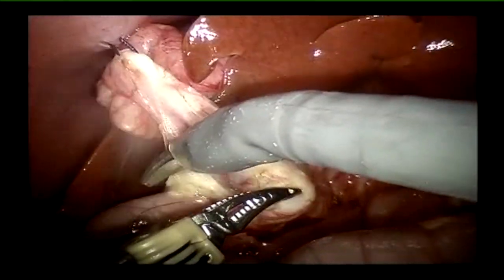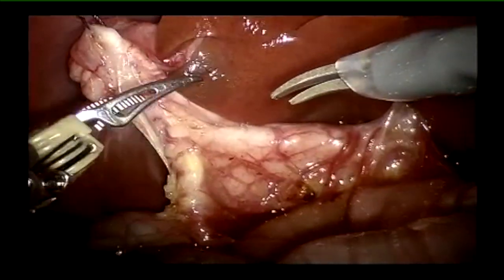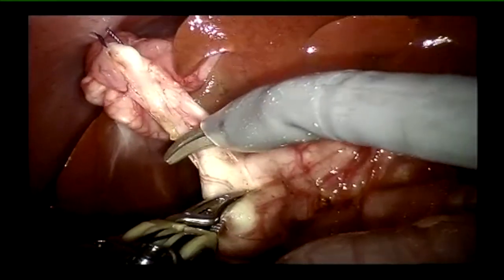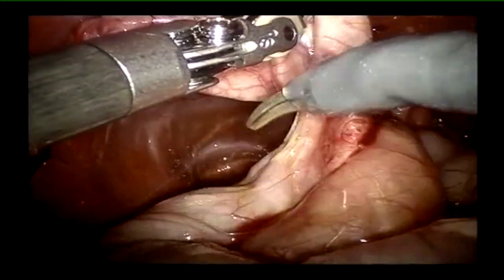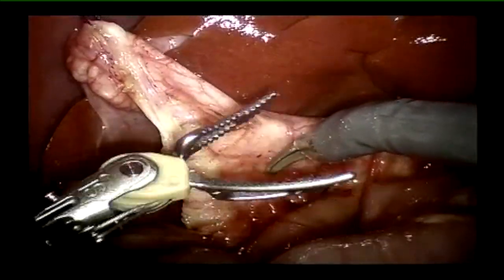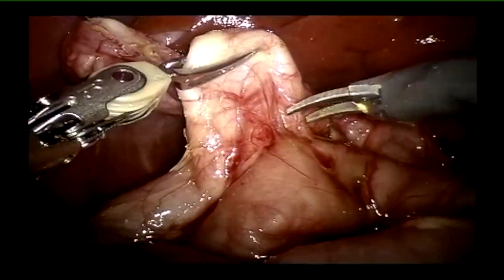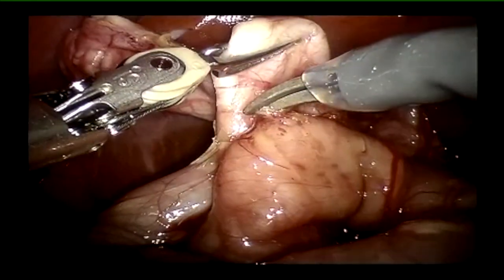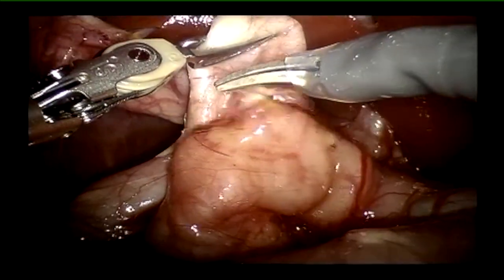This also prevents the need for an additional port just for liver retraction. Should small kids be operated on in the beginning? No — you need a reasonable amount of dexterity with robotic instruments before proceeding in such small patients. The number of cases or experience required is not really a fixed parameter; it all depends on how comfortable you get with the robotic platform.